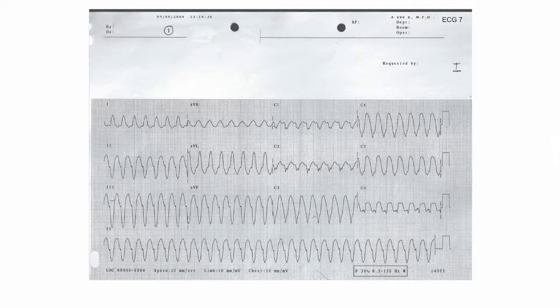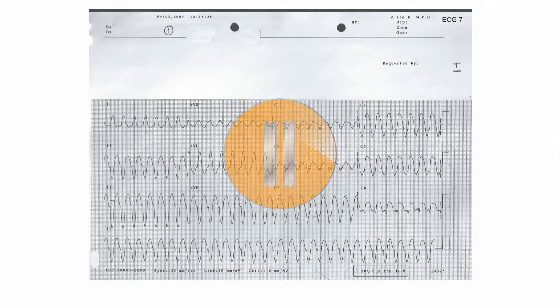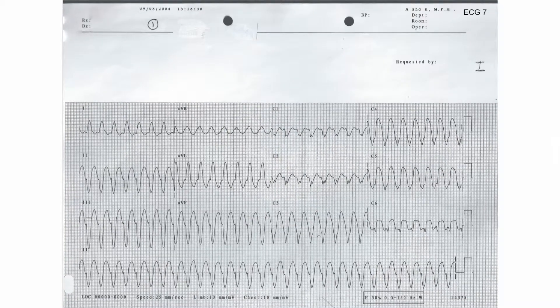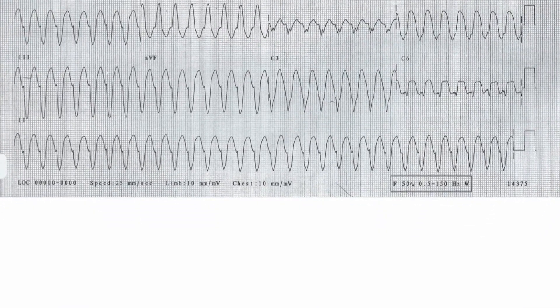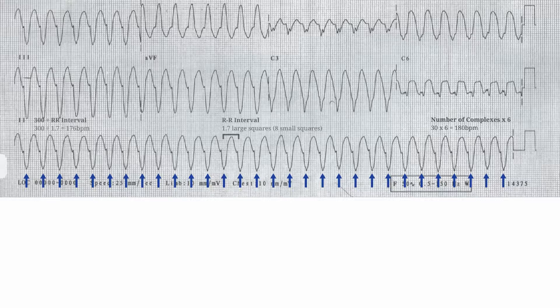This is the 12-lead ECG of a patient with hypotension and palpitations. Pause this recording now and interpret the ECG on your own before pressing play again. The rate is 180 beats per minute. The complex is broad, and this is therefore a broad complex tachycardia. This should immediately make you think of ventricular tachycardia, which is a medical emergency, and help should be sought from a medical expert at this point.